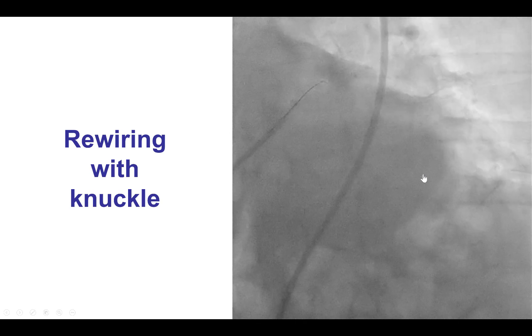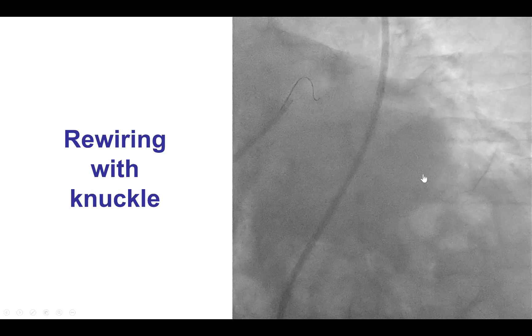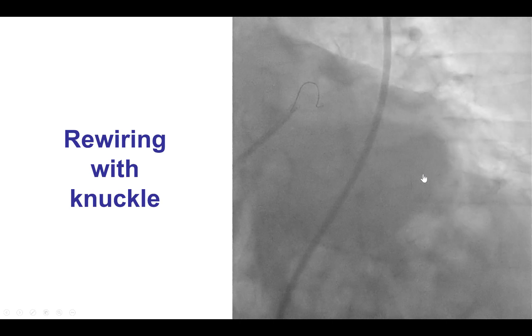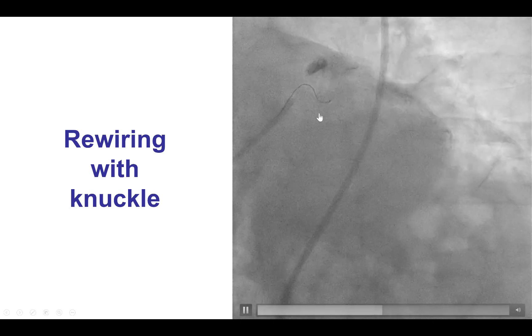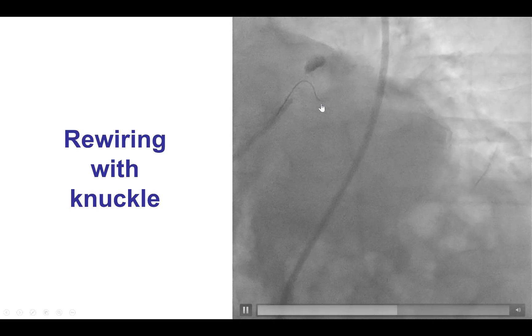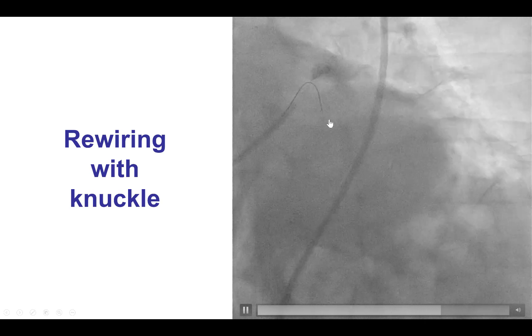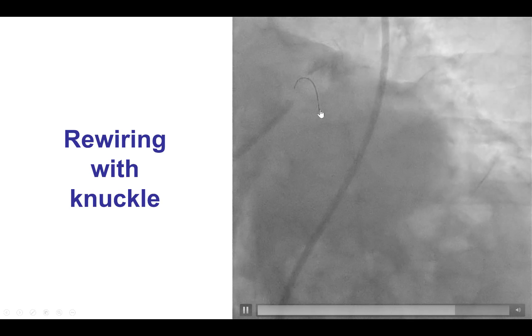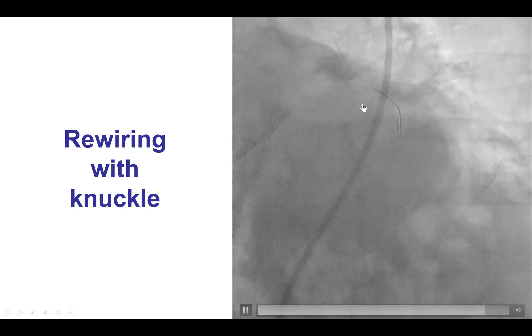So we had to rewire the vessel, which was done similar to the first time with a Workhorse guide wire. Now it tended to favor going to the obtuse marginal branch, but then it could be redirected into the circumflex.